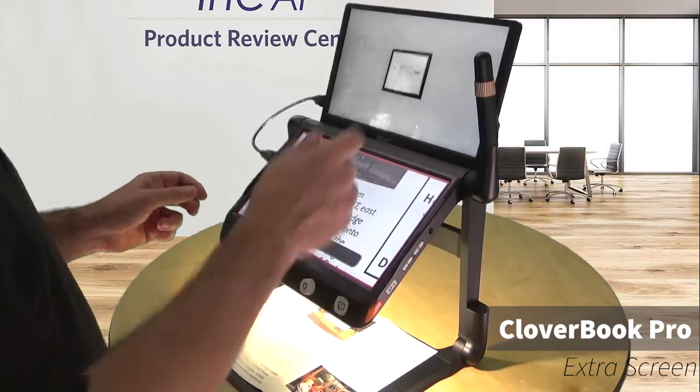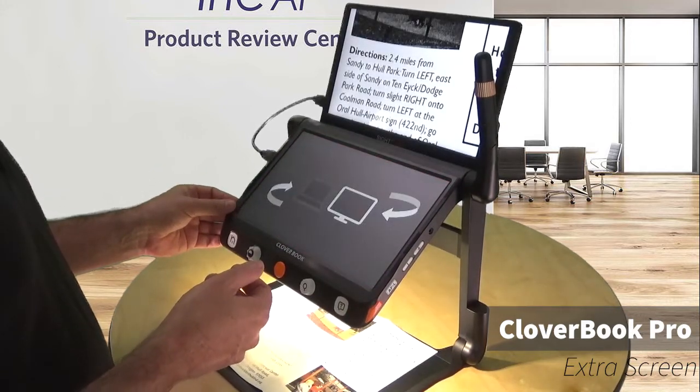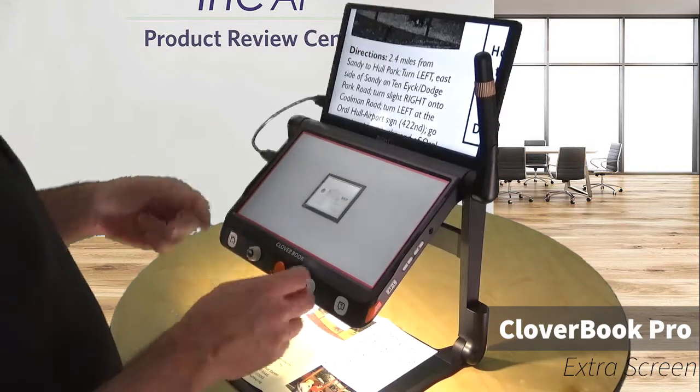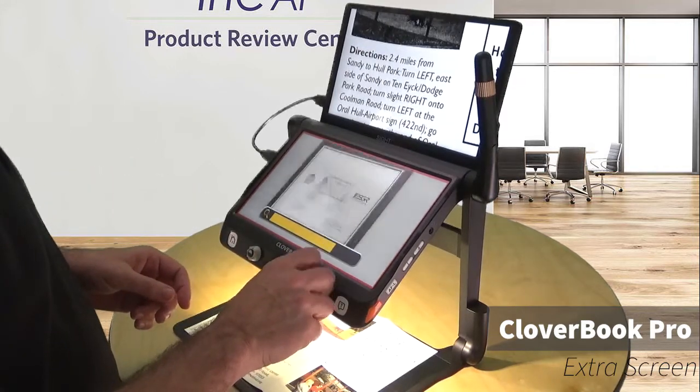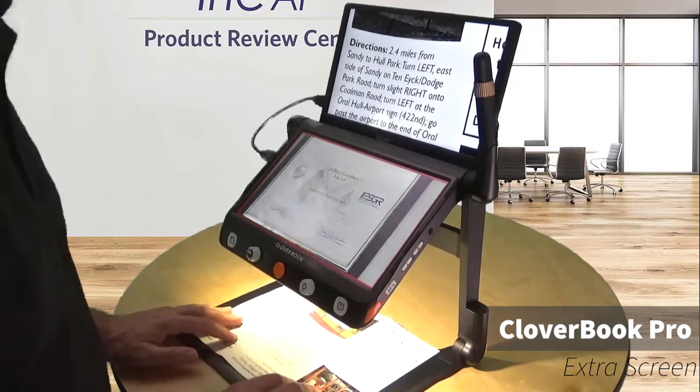And then I can still see in a distance. Now if I want to control that camera, I just hit it again. Now I've got my close view up here and my distance here. I can zoom in, check out what the presenter's doing. Still have a desk view up here for taking notes or whatever.